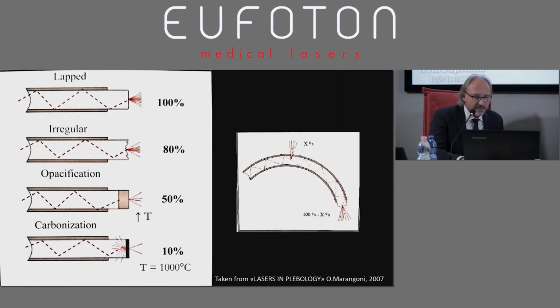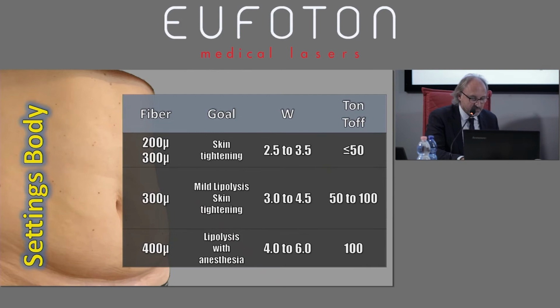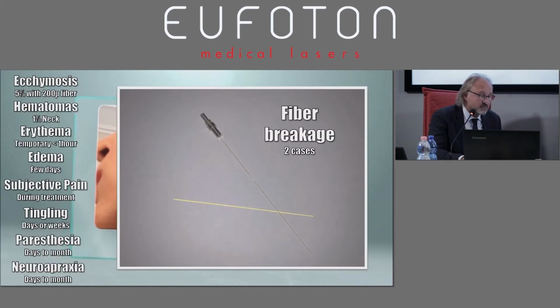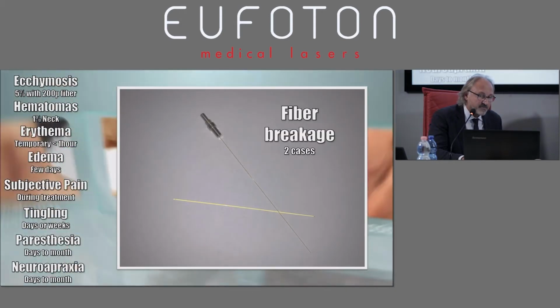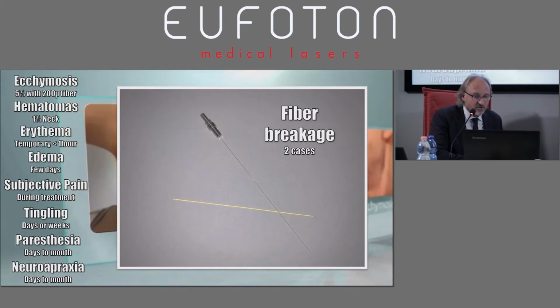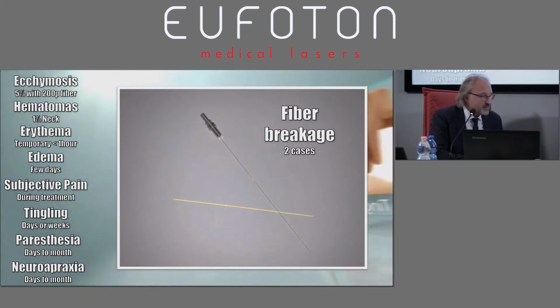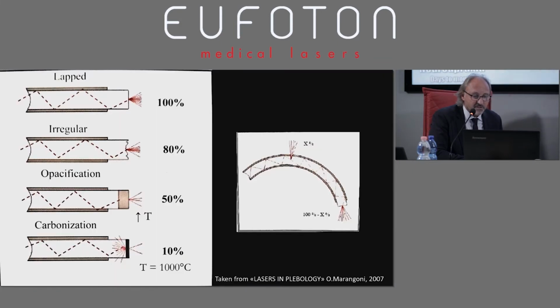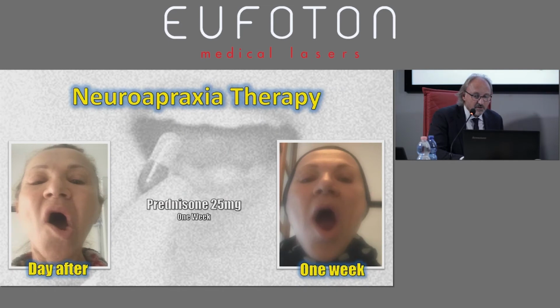So complications, I already said. I skip complications. What shall I do? Are you going to talk about complications: ecchymosis, hematomas, erythema, edema, subjective pain, tingling? So, I'm showing you these complications.